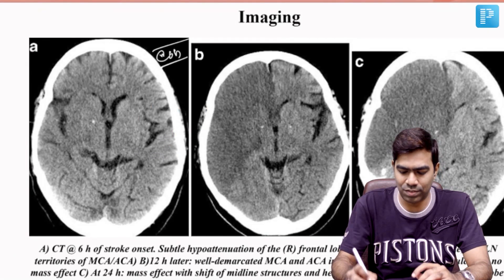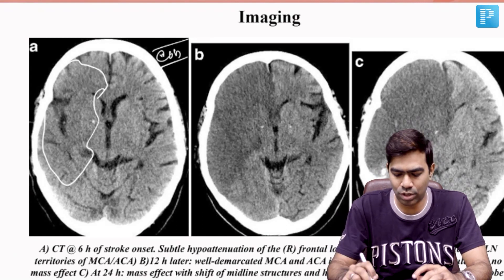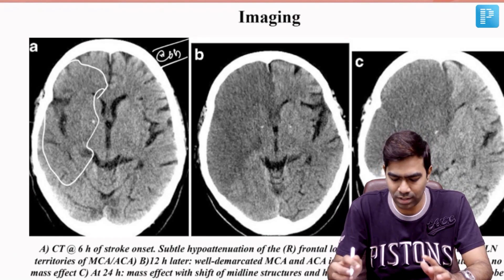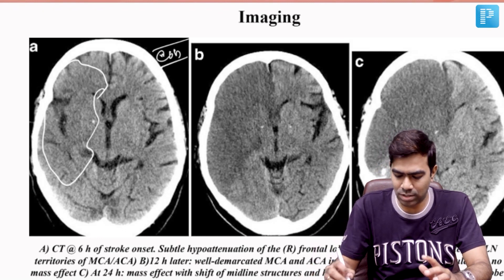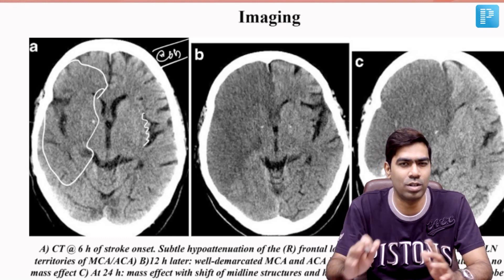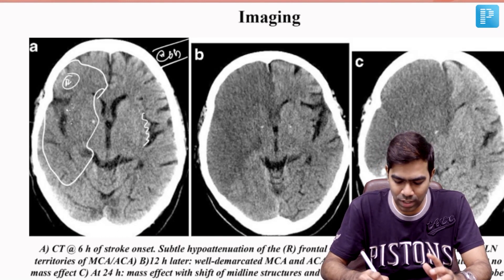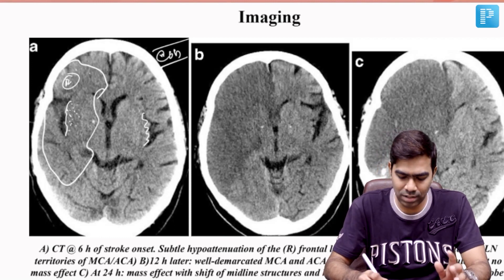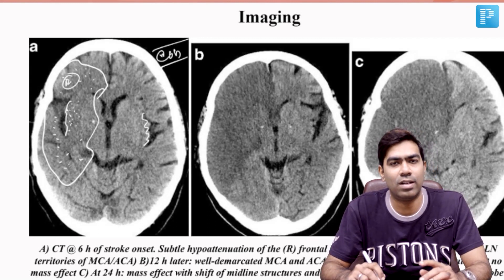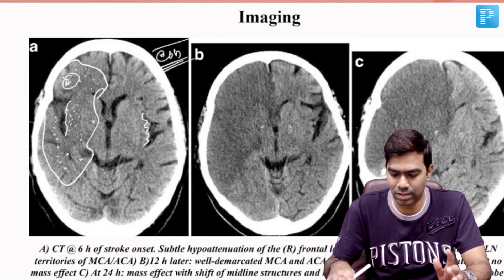This was a CT done at six hours of stroke onset, and you can definitely see something wrong in the ACA and MCA territory region. The insular cortex on the left side is normal with good sulci and gray-white differentiation. On the right side, however, I'm not able to tell the gray-white differentiation, and there is a bit of sulcal effacement in the frontal and parietal areas, along with visible hypodensity.